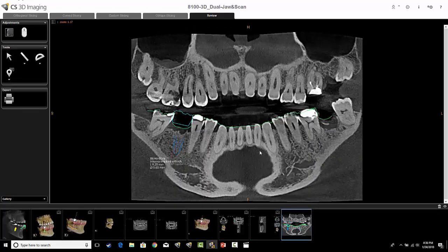That DICOM screenshot is only used in different DICOM viewers. You can't take this image and put it into a Word report, PowerPoint, or an email — whereas JPEG images you can. Down in the gallery you can differentiate which one's a JPEG and which one's a DICOM. The little camera icons signify it is a JPEG image; no icon signifies it's a DICOM image.